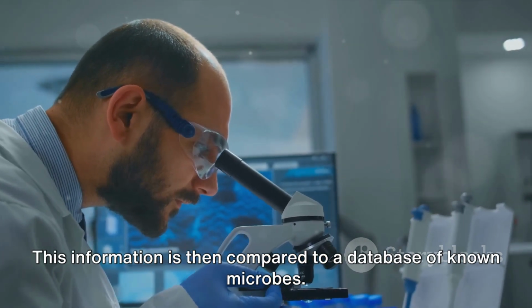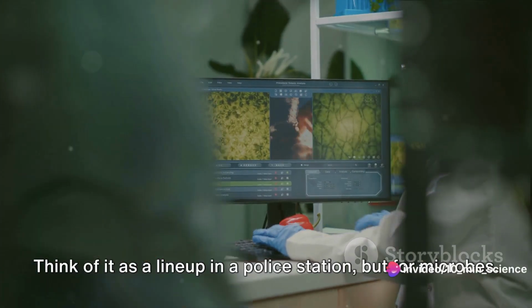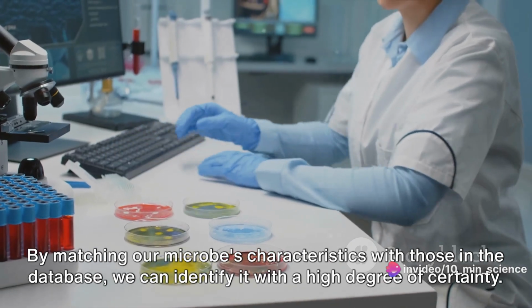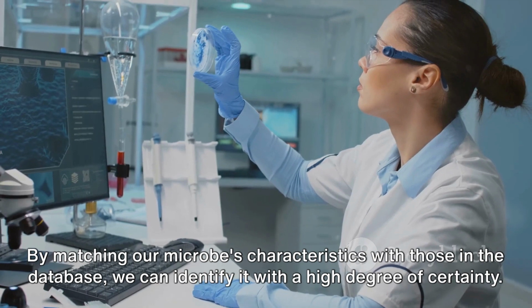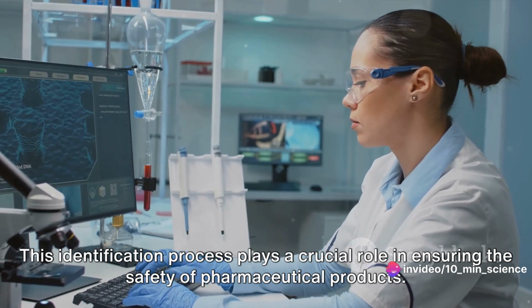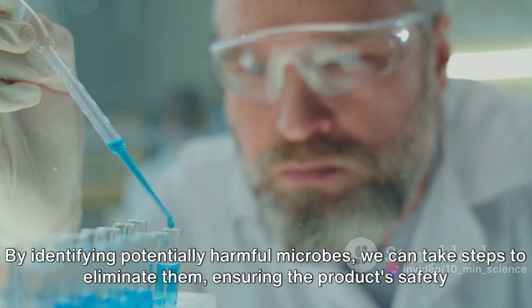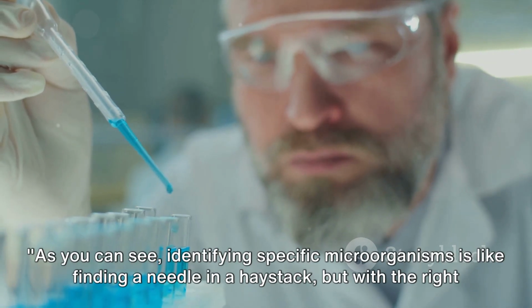This information is then compared to a database of known microbes. Think of it as a lineup in a police station, but for microbes. By matching our microbe's characteristics with those in the database, we can identify it with a high degree of certainty. This identification process plays a crucial role in ensuring the safety of pharmaceutical products. By identifying potentially harmful microbes, we can take steps to eliminate them, ensuring the product's safety and efficacy.